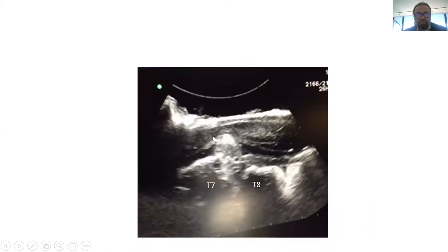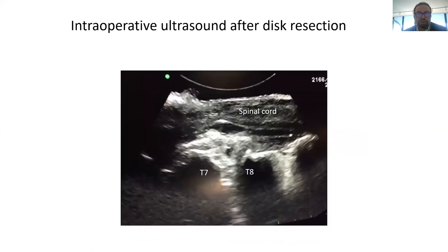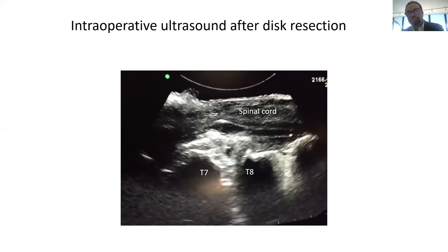You get an ultrasound before decompression — that's the disc, that's your spinal cord, that's the disc pushing on the spinal cord from the front, and that's your ultrasound probe. You can see a lot of pressure there at T7-T8. After removing the disc, you get another ultrasound to confirm you've done the job, because you can't retract the spinal cord to visually check — you have to see through the ultrasound.